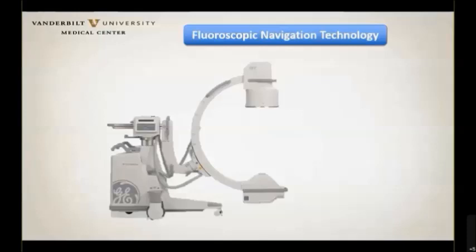Okay, so there's really not a ton of ways to visualize the peripheral lung. We talked about radial ultrasound very briefly.